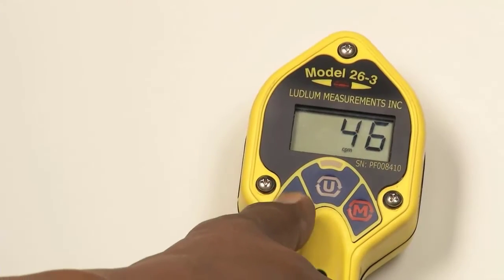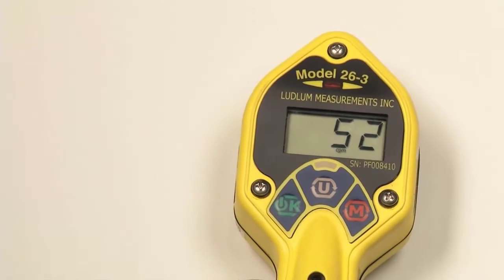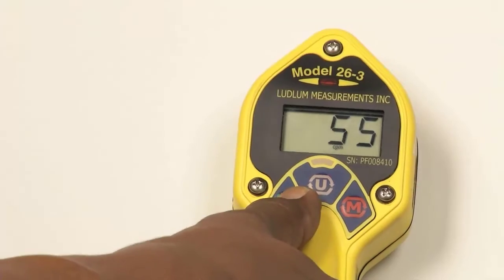To silence the clicking audio, press the OK button. To turn the clicking audio back on, press the OK button again.